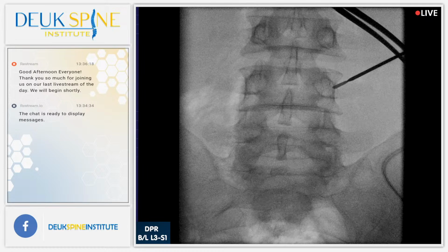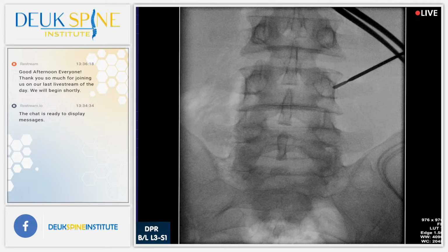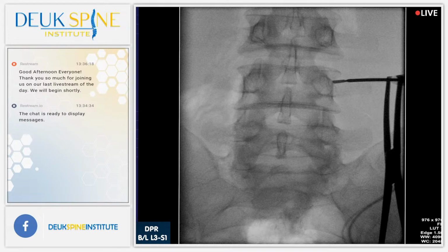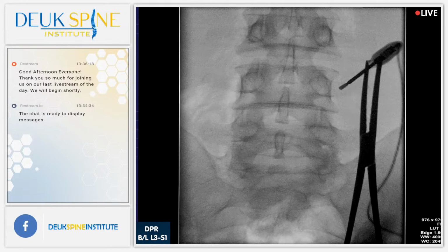Any question? No current questions. Yeah, his muscles are just jumping a little bit, but I think we're fine. Still getting a good burn where we need to.